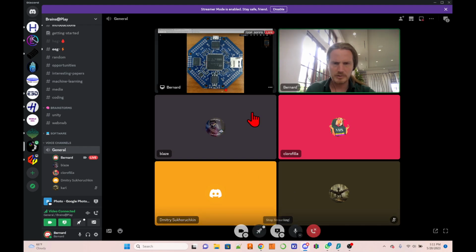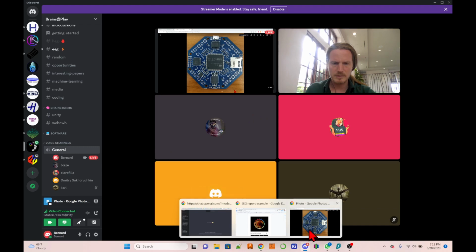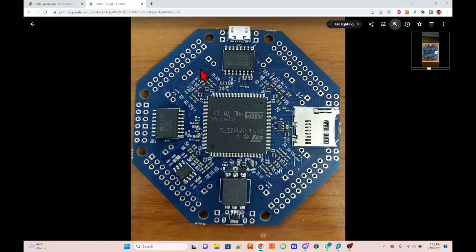So I'll go back to the. And another correction, maybe I recognized it incorrectly, but inside the board there are minuses, and outside the board are pluses. Yeah, yeah. This is different than in Cyton.